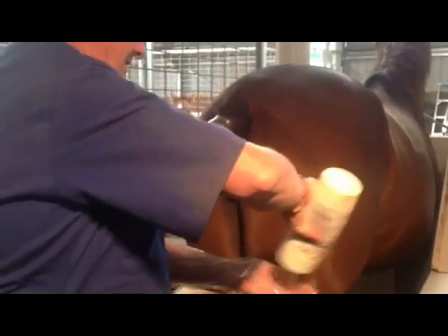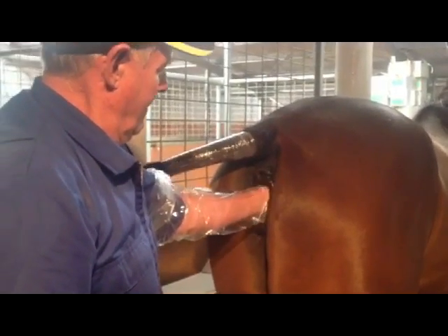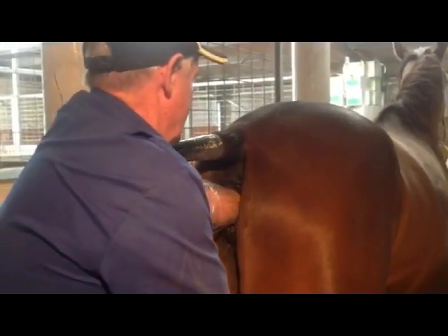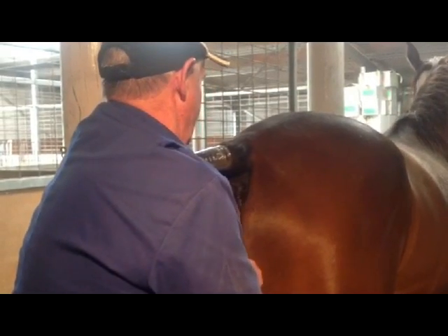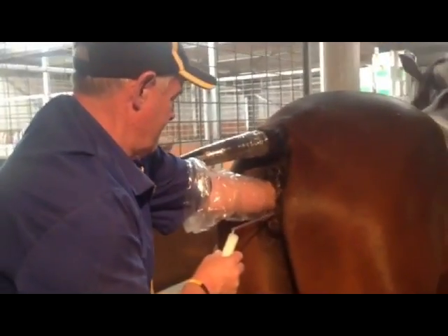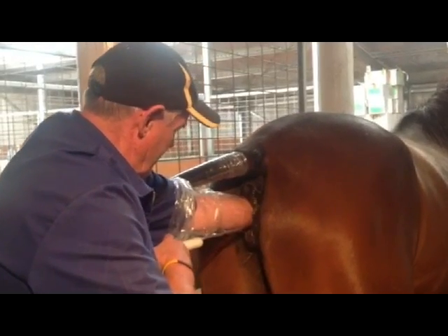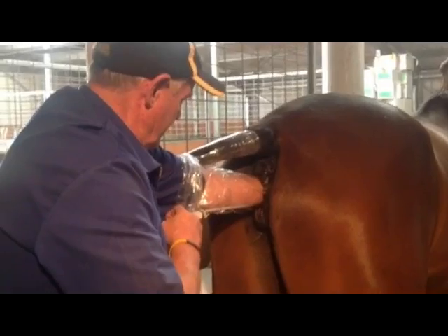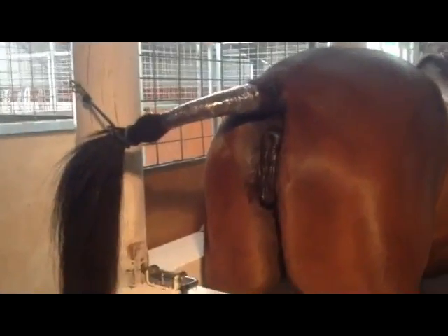I have a slightly different method. I don't actually put the pipette into the vagina with my hand to start with — I actually enter the mare quite quietly. Then I have my pipettes in a sterilised area beside the crush, and just by lifting the arm I can open a small area and pop the plastic pipette in underneath my arm. I locate the entrance to the cervix with a forefinger, and then guide the plastic pipette through the cervix — it usually goes in about six inches. I actually attach the syringe after I've got the pipette well into the cervix, and then gently force the semen in through the syringe. Quite important you don't get too much air in there as well. Then I take the whole lot out, put it in the rubbish, and the job's pretty much done.